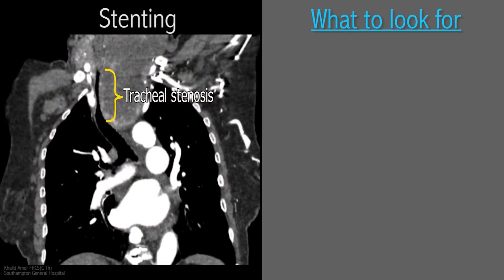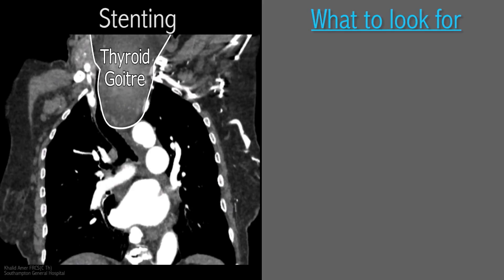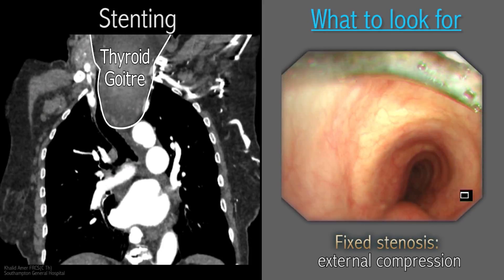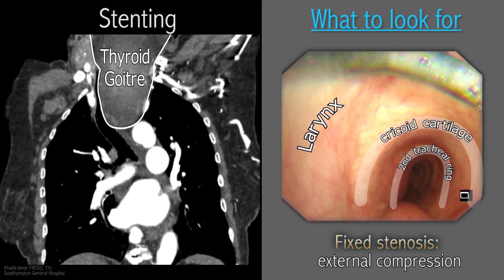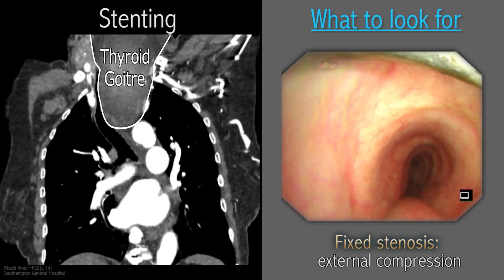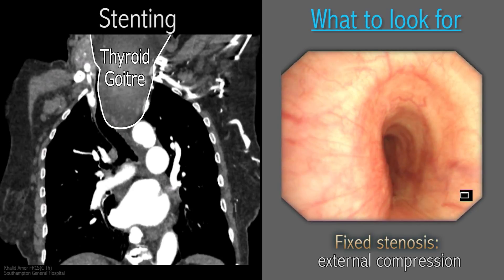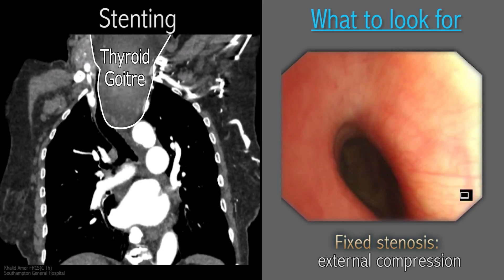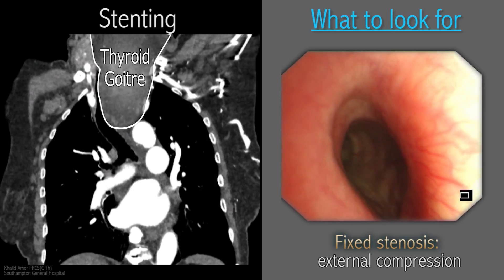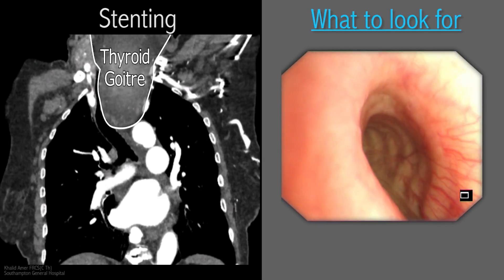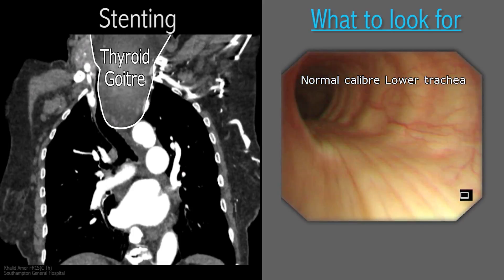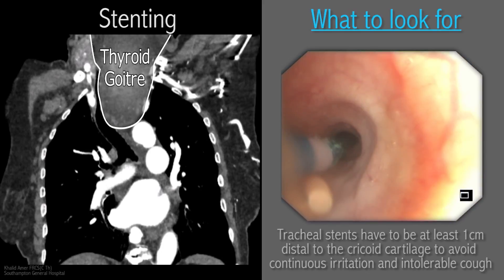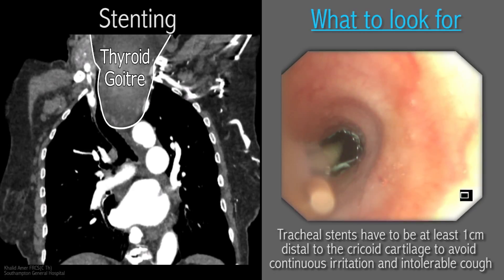The next footage shows the CT scan of a lady with neglected large thyroid goitre, which has led to airway compromise. Initial bronchoscopy revealed significant main stem trachea stenosis from just below the cricoid to the lower third of the trachea. The profile of the trachea resembles a saber-sheath trachea due to external compression, with the maximal point of stenosis at about the mid-tracheal point. A stent was needed, and we chose to launch a self-expanding S90 non-covered metal stent, which starts launching from its distal end.